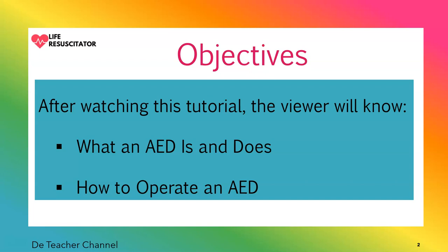You will have known what an AED is and what it does. After watching the video, you will also be very comfortable operating an AED. Those are the two objectives that this video wants to achieve.